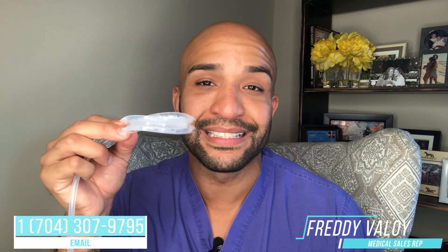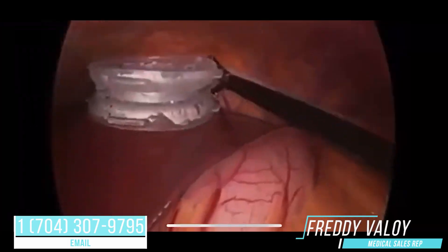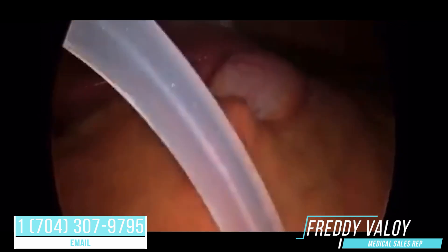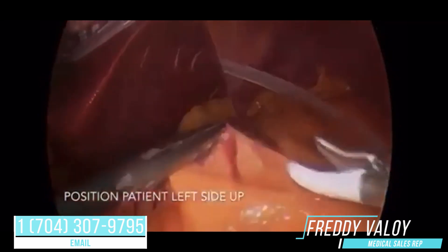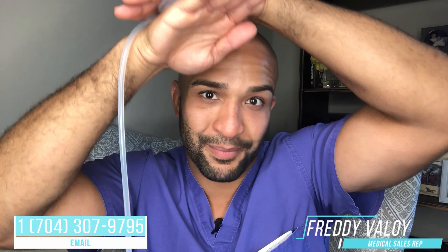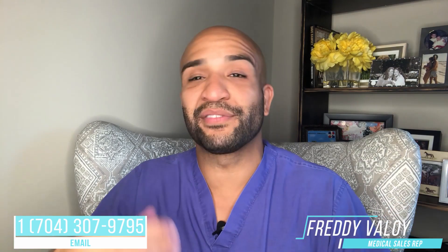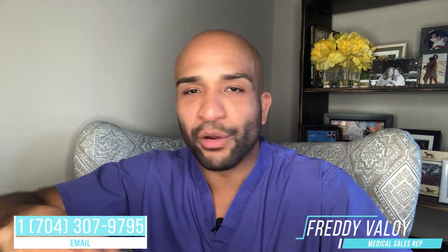You insert the product through an existing incision. Here's the diaphragm, here's the liver — suction goes on, moves the liver out of the way. You see that? Boom. This suction does not damage the liver, removes the need for an extra port, and you don't have to have any hand assistance for a retractor. You don't have to worry about repositioning retractors or anything like that.